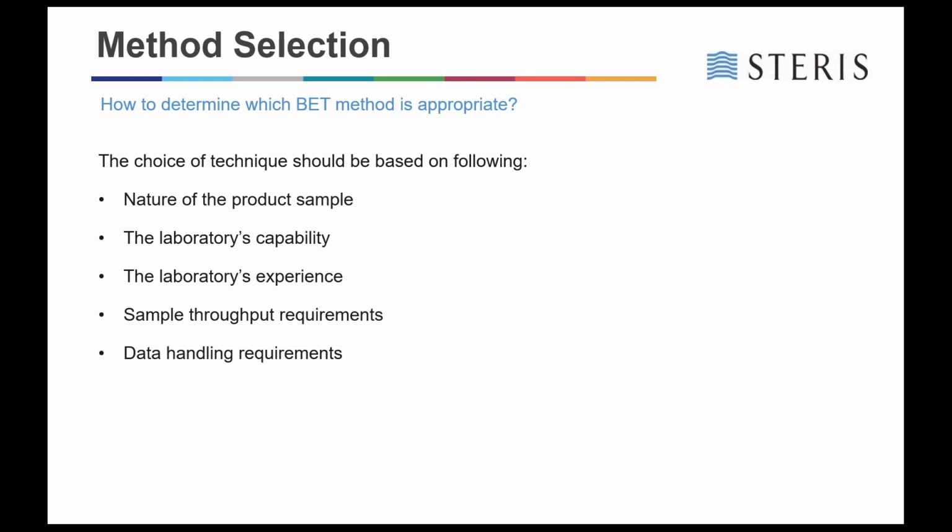All right, now that we have a pretty clear understanding of the details of the bacterial endotoxin testing, we're going to dive in a little bit closer into the ISO standard requirements and other standard requirements and do a little comparison and contrasting with those standards.